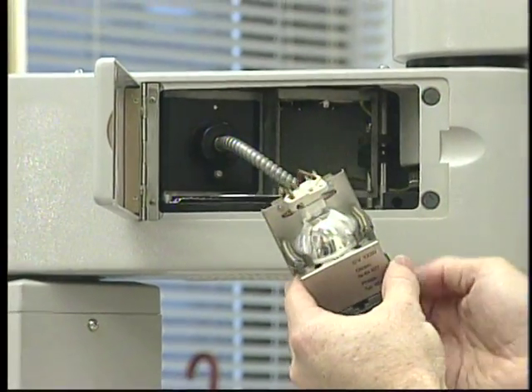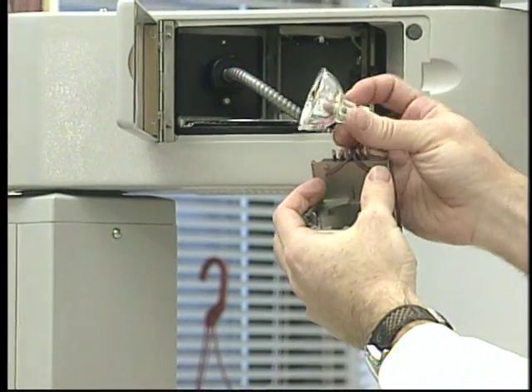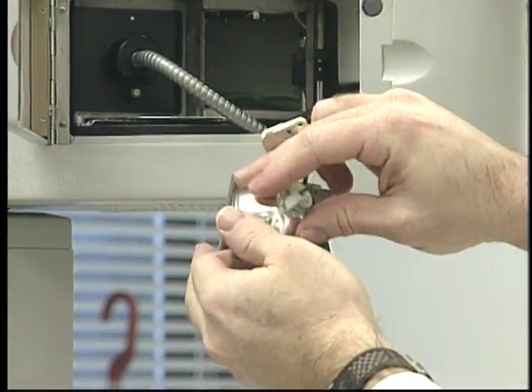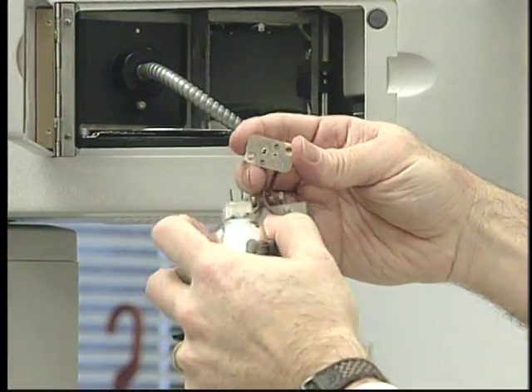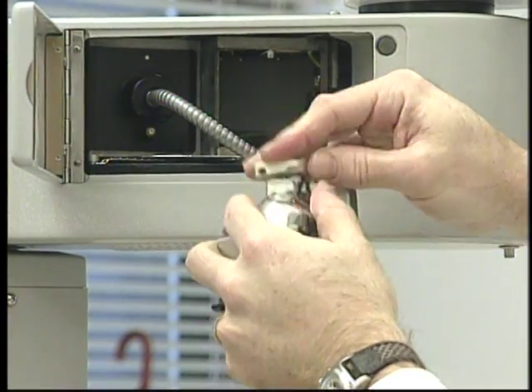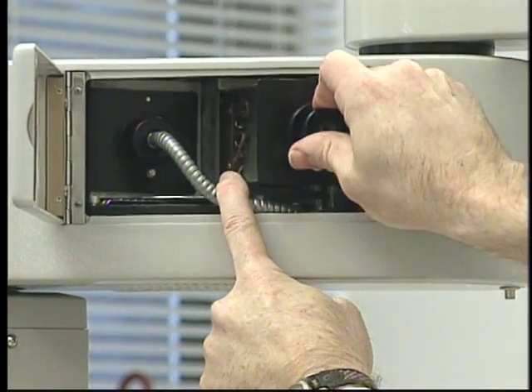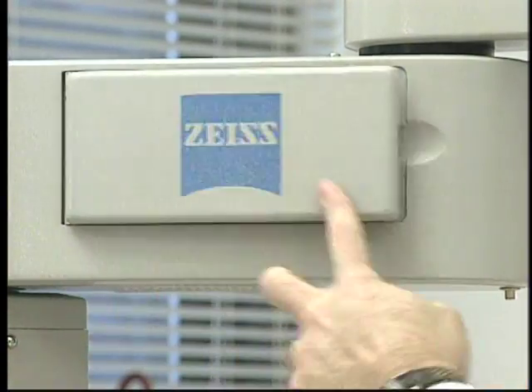This is the module. What we do is we remove the bulb, unplug this thing, change the bulb, put it back in place, put this thing back together again, like this, and then just slide it back in the drawer. And then close it up.